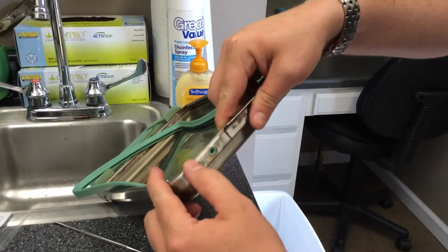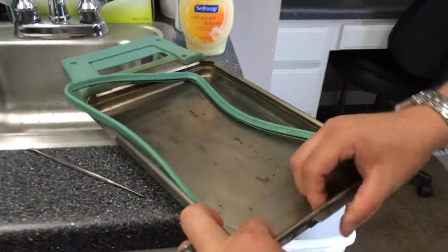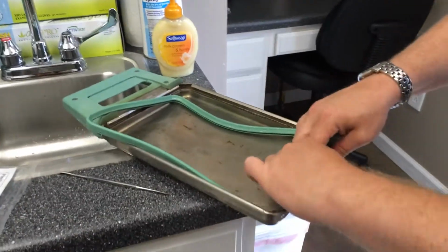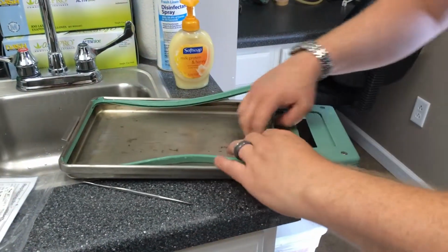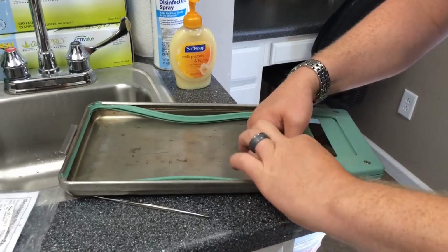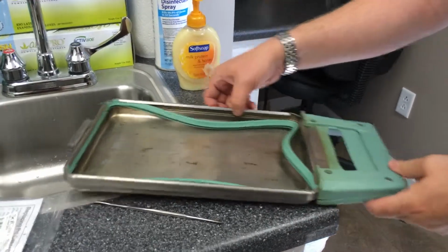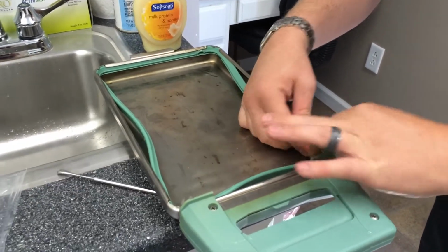So it should really fit smoothly with no strain, so that the circles are perfectly concentric. And at that point you can just push your fingers on the gasket, make sure that corner is done. Then you'll go to each of the other corners using the nubs as guidelines again. And if the cassette is very slimy, it'll be very easy to do. Just tuck it up under the lip.